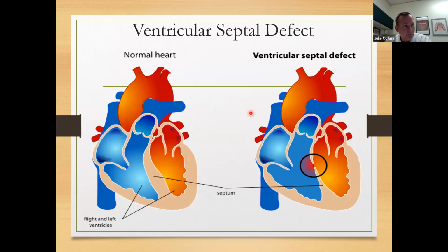Left ventricle through your pulmonary artery. Pulmonary artery or pulmonary vein? I mean pulmonary vein, through the pulmonary vein into the left ventricle. All right. So usually they're right superior pulmonary vein vents, where that's where they enter. They're introduced into the left atrium, hopefully past the mitral valve, and hopefully they sit here.